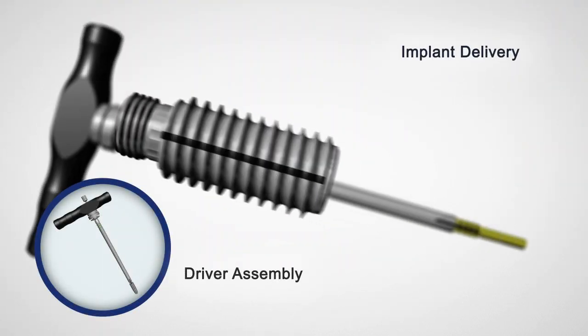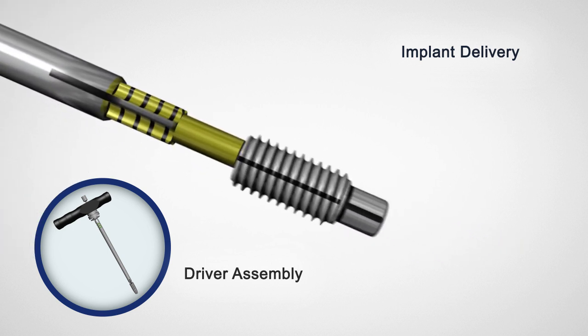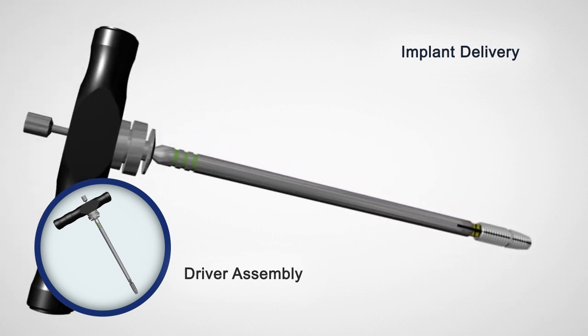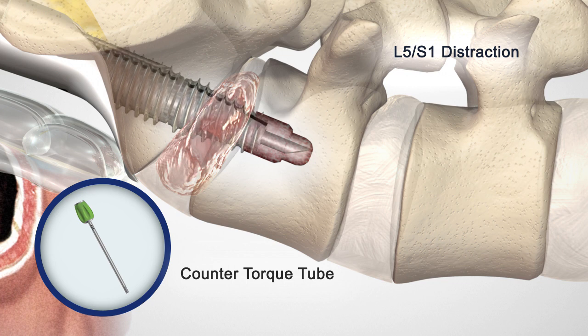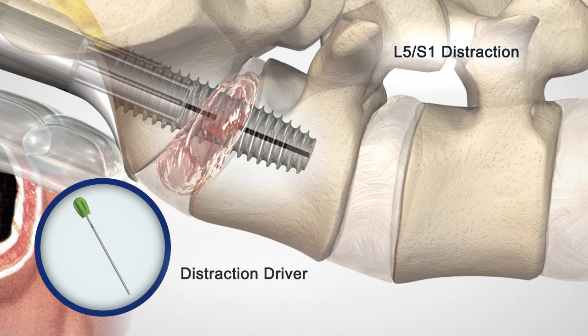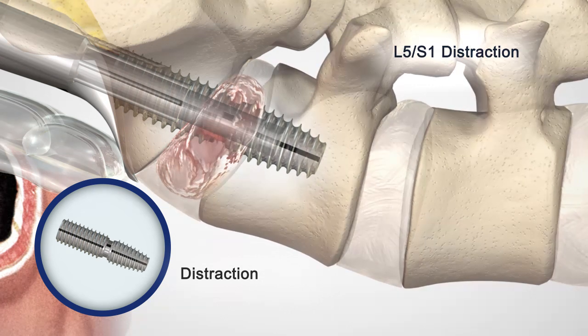Assemble the selected L5 anchor, distraction rod, and S1 anchor onto the dual driver and insert into the prepared channel simultaneously. Use the counter torque tube and distraction driver to advance the internal distraction rod. They are designed to distract the L5-S1 vertebral bodies, restore disc height, and indirectly decompress the neural foramen.